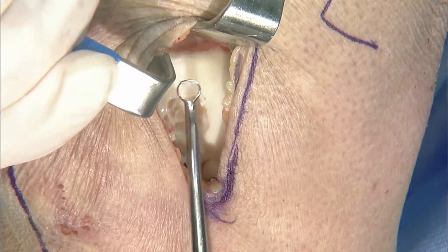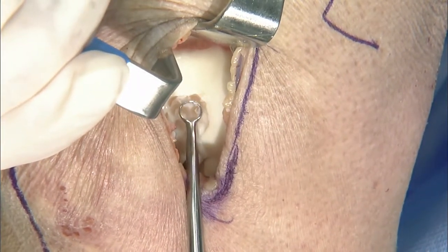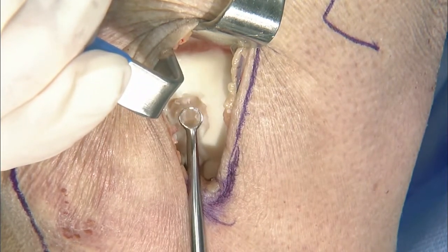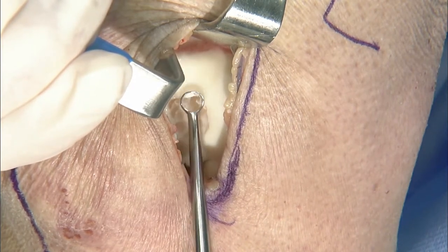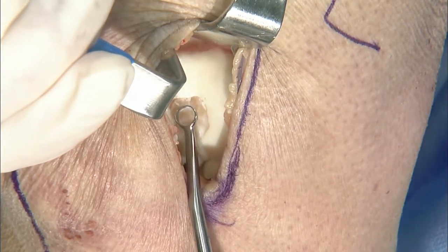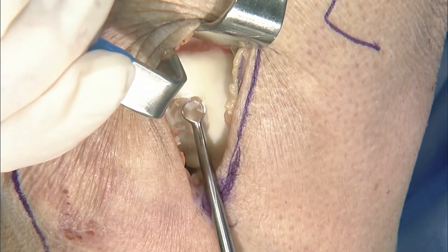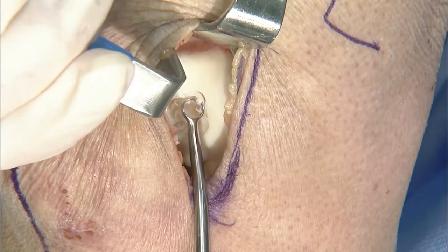One thing that I'll do is, especially in the patellofemoral joint where I find that the cartilage is a bit thicker, we'll look at that subchondral connection to the cartilage. Because oftentimes you can have some fraying, a little bit of delamination on this upper surface here. But then you get down to this lower surface here, and there's a pretty healthy connection to that subchondral bone. That will tell me that I'm getting to a point where I'm going to stop pretty quickly.